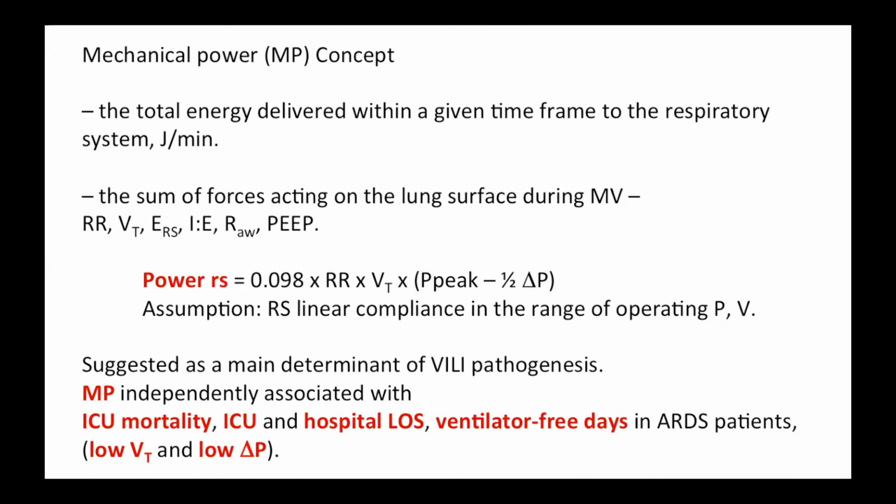The respiratory rate, the tidal volume, the elastance of the respiratory system, inspiratory to expiratory time, the airway resistance, and positive end expiratory pressure, all combined in the power of the respiratory system equation. We of course assume in this simple equation that there is linear compliance in the respiratory system in the range of the operating pressures and volumes.